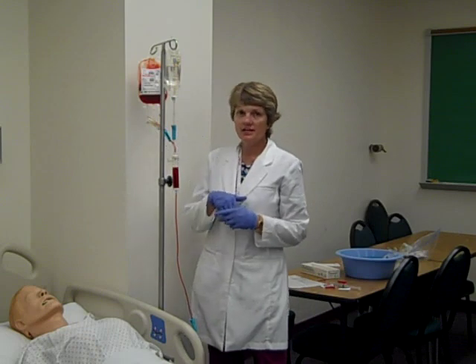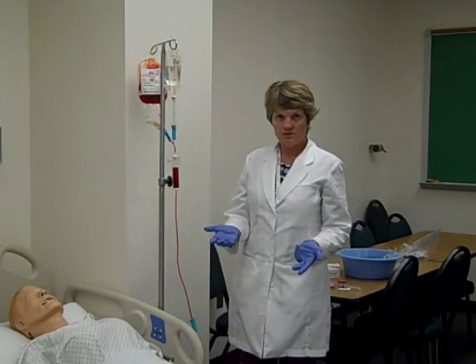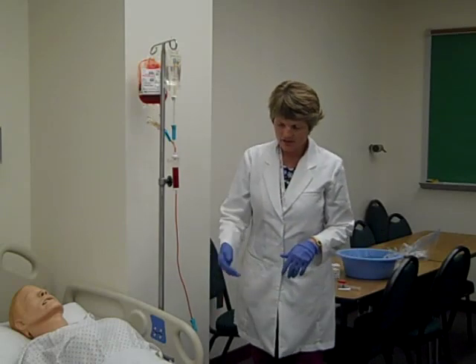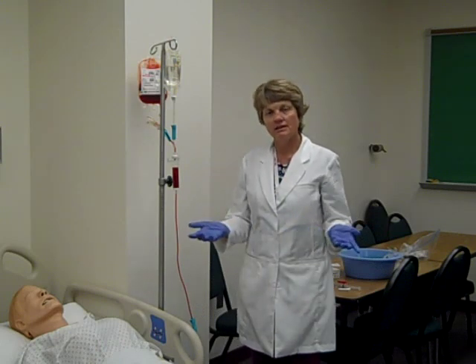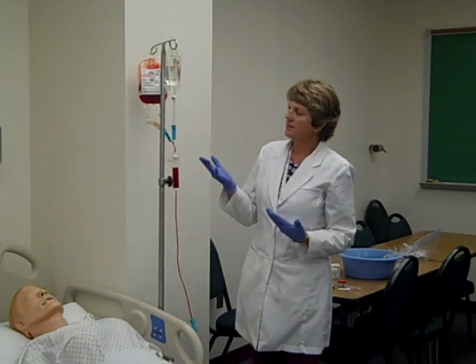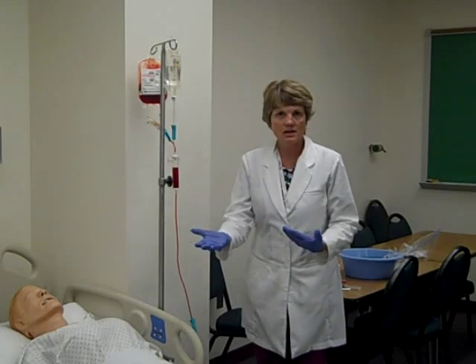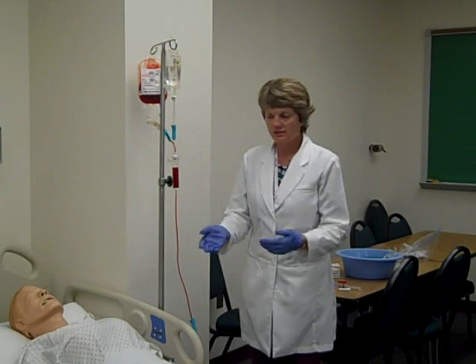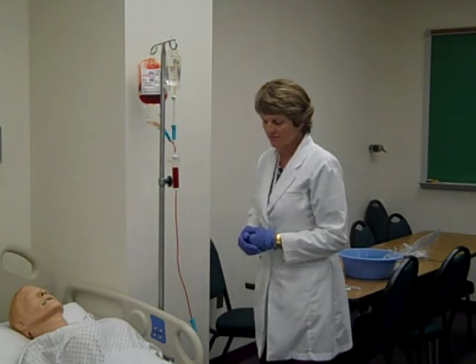I hung a unit of packed RBCs. I could document the vital signs and what they were pre-transfusion. That they had a number 20 angiocath in their left antecubital area, patent without complications, and that their lung sounds are clear, so I can document the donor unit number, and that the patient tolerated the procedure well currently. We'll continue to monitor and follow as per hospital policy.